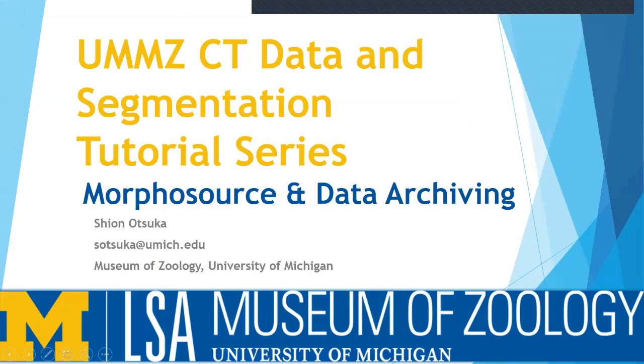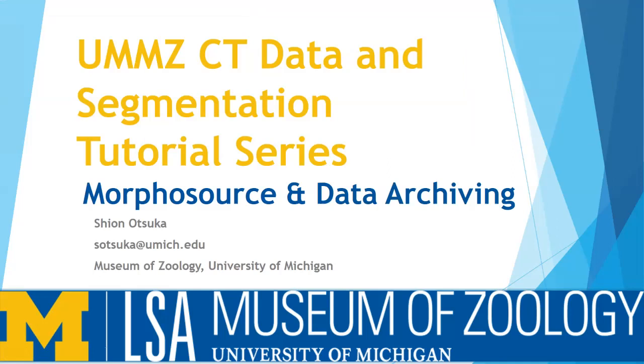Hi and welcome to the third video in the UMMZ CT data and segmentation tutorial series. I'm Xian and today we'll be talking about uploading data onto MorphoSource.